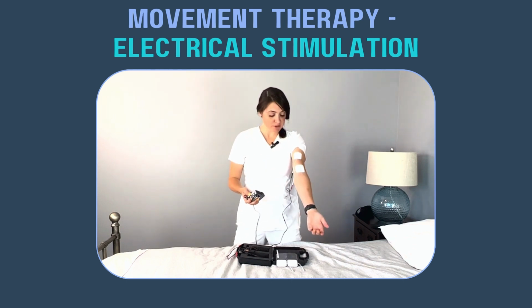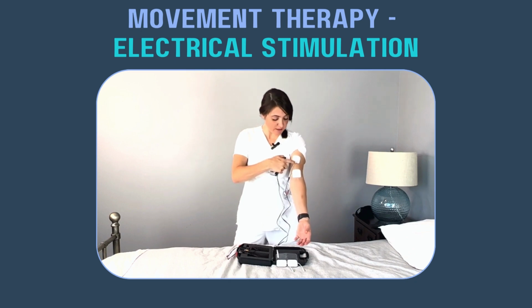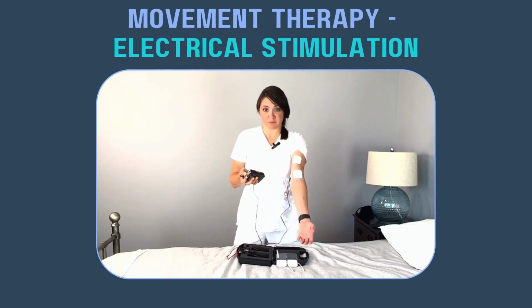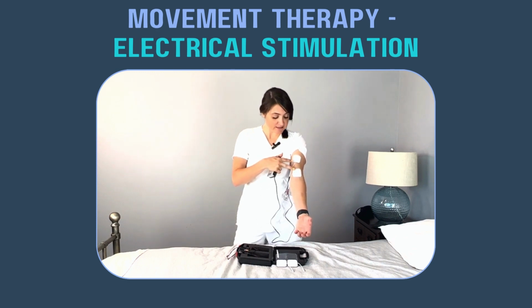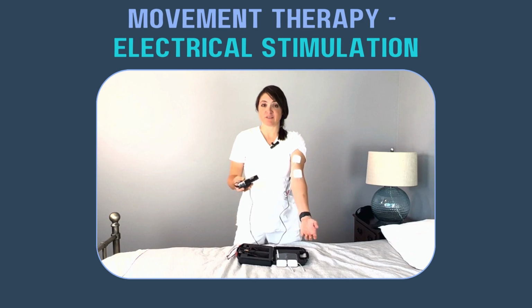What I always do is place the electrodes on the person and warn them that I'm going to turn it on. Once you turn it on, you ask them when they feel something. Okay, I feel it now. I feel a little pulse. It just feels like a tingly pulse right in the muscle. And now I'm not moving my arm. This machine is actually starting to move my arm for me, because it's sending an impulse to my bicep saying, hey bicep, I need you to move or contract. So let's get started on all the areas that you can safely place an electrical stimulation TENS unit on a muscle to get it moving again.